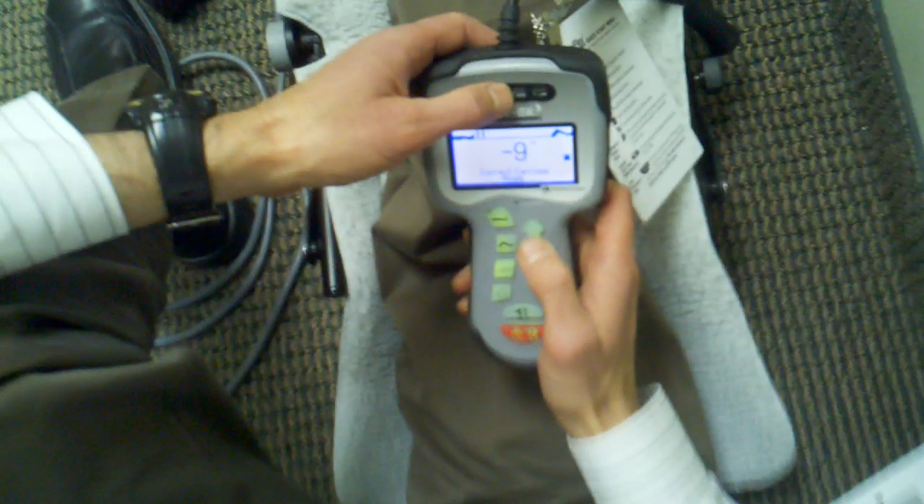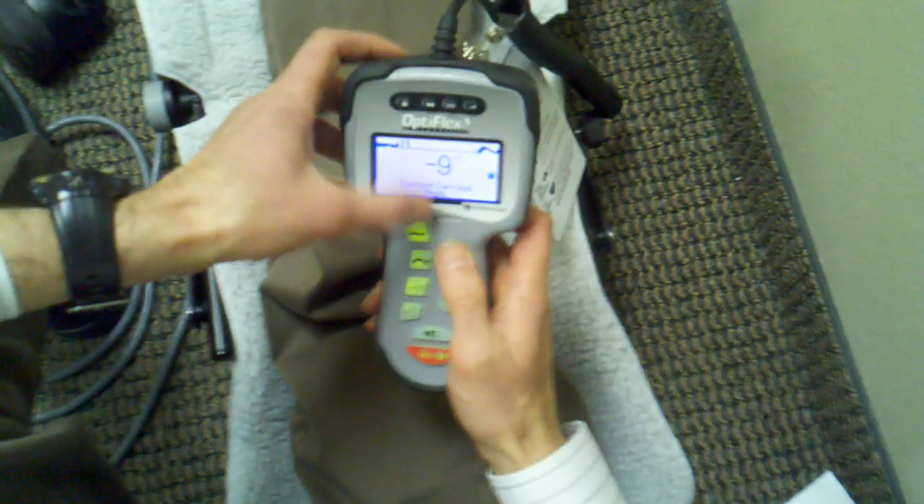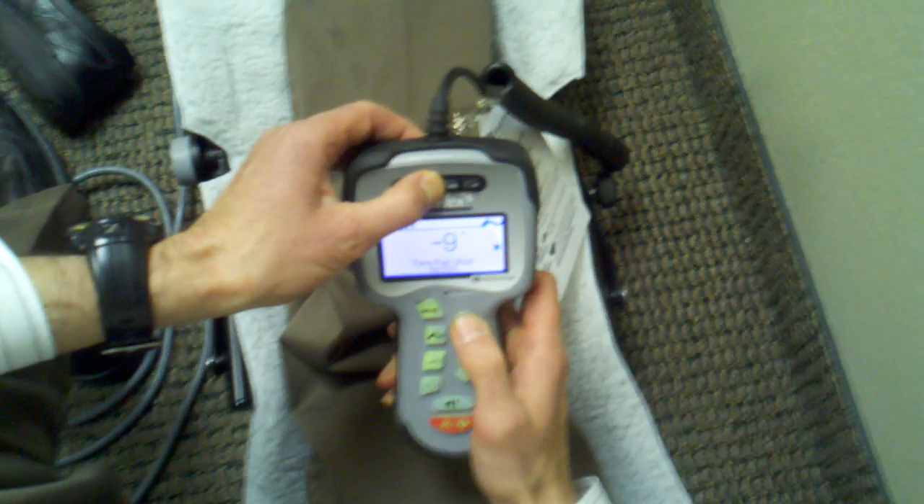This is the actual box that it came in. This is the actual machine and it does give you the directions of how to install it. It's really not all that difficult — it took us maybe three minutes to get it done. It plugs in, it's a pretty long outlet, and it does come with the booklet.